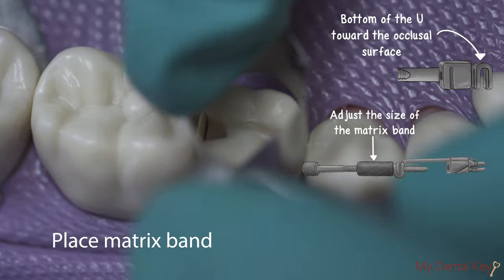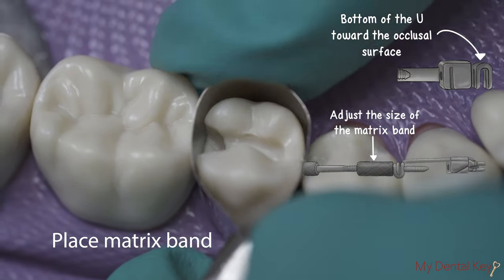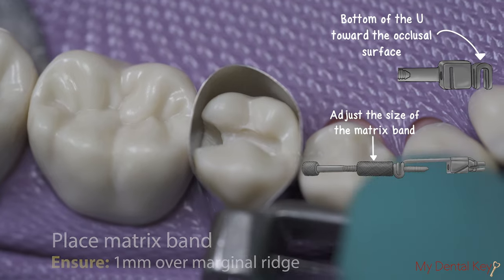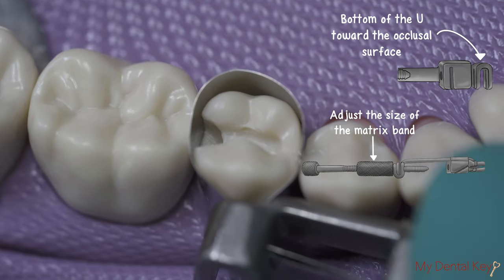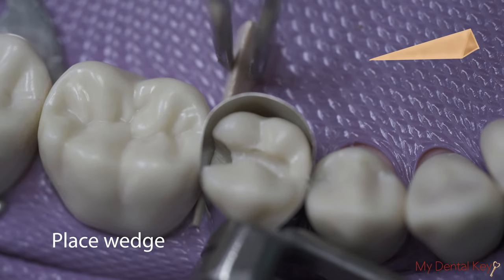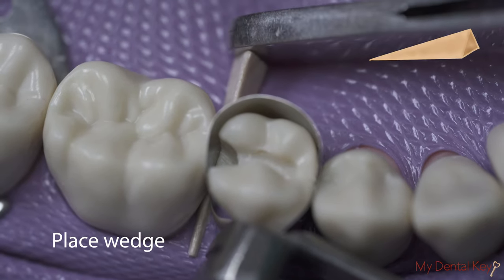Place the Toffelmeyer matrix band around the tooth. Ensure that the matrix band rises approximately 1 mm over the marginal ridge. Secure the matrix band by placing a wedge in the buccal and lingual embrasures. Insert the wedge from the lingual using your forceps.